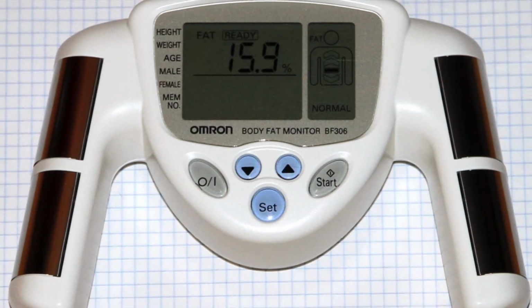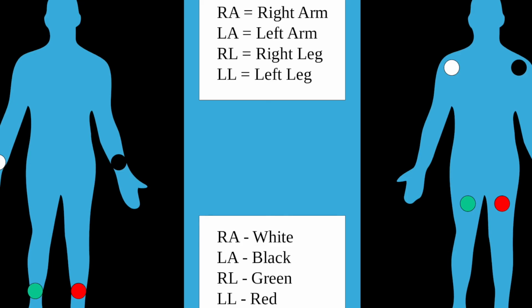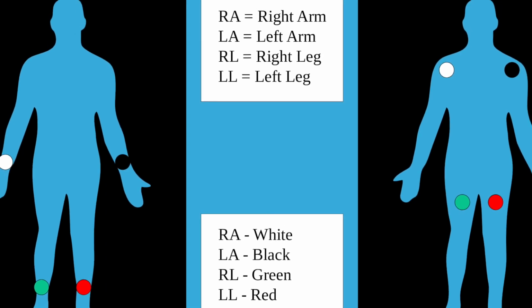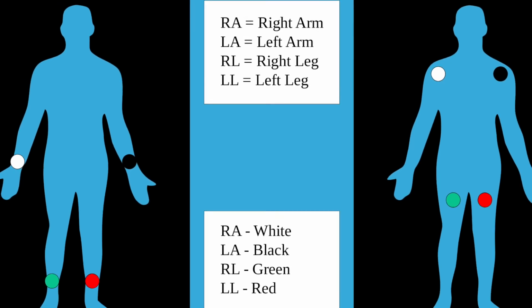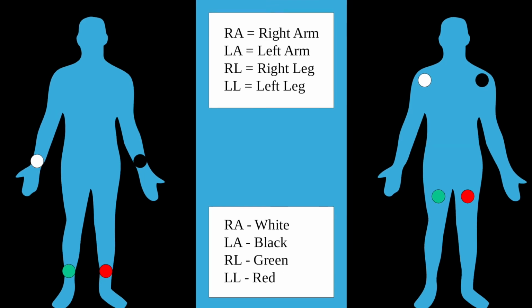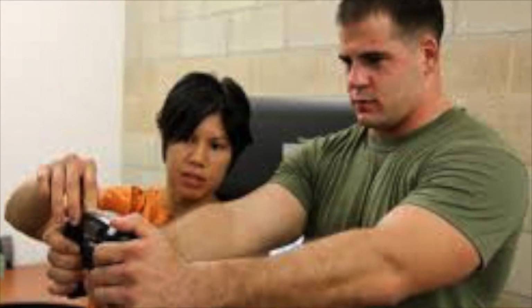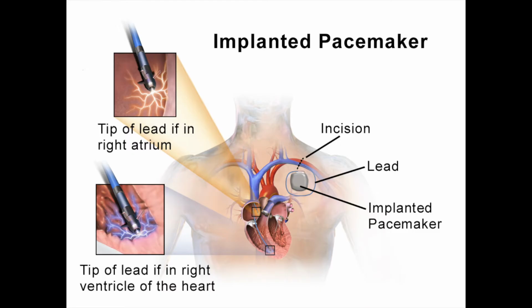Bioelectrical impedance is an electrical solution that also calculates body composition. This particular method measures flow of current between electrodes placed on the body to provide an estimate of body water present to calculate fat. It is advantageous as it is minimally invasive, but is not recommended for those with implanted devices, as the electrical current can interfere with things like pacemakers and internal defibrillators.